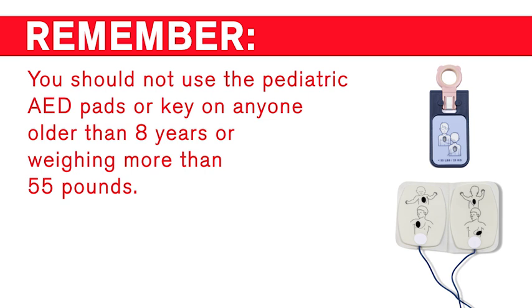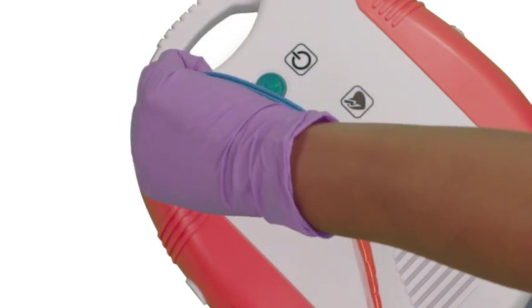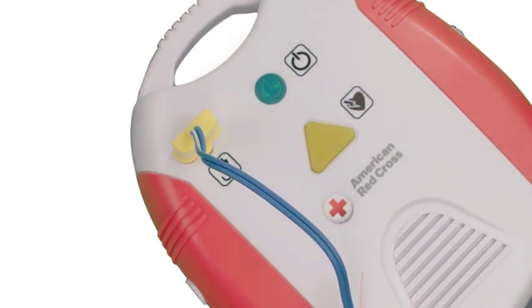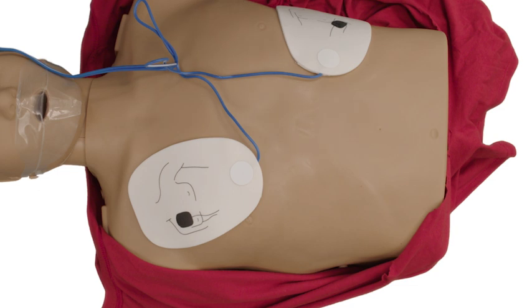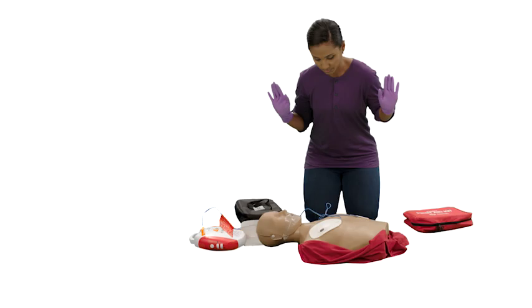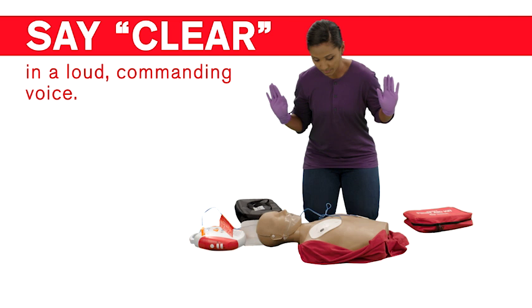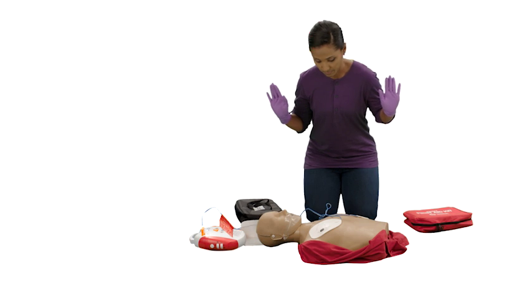than 55 pounds. Plug the pad connector cable into the AED if necessary and prepare to let the AED analyze the heart's rhythm. Make sure no one, including you, is touching the person. Say, "Clear," in a loud, commanding voice. Be ready to deliver a shock if the AED determines one is needed.